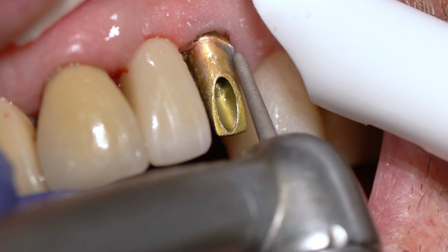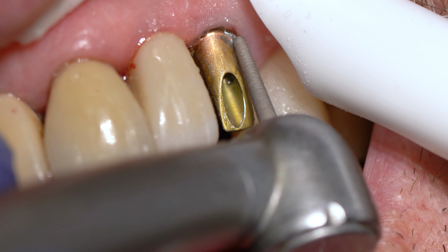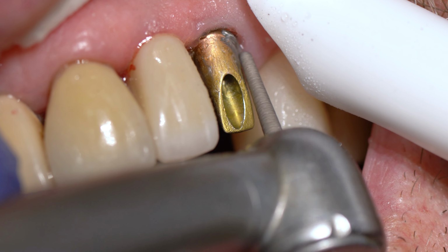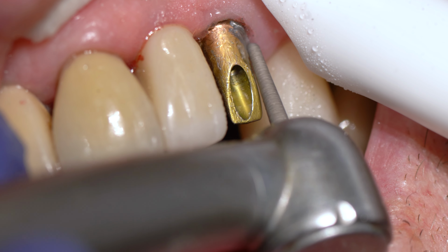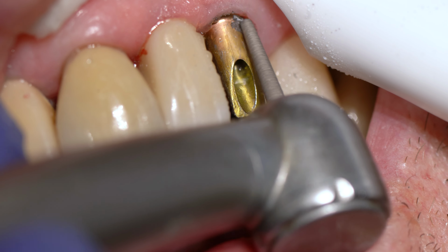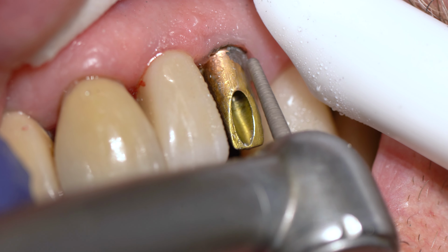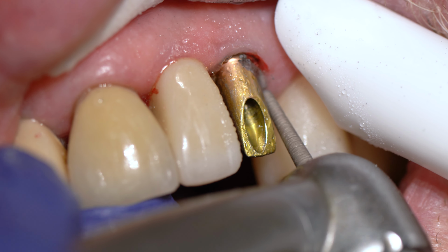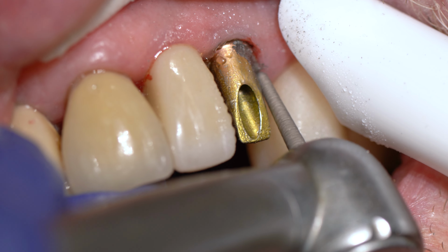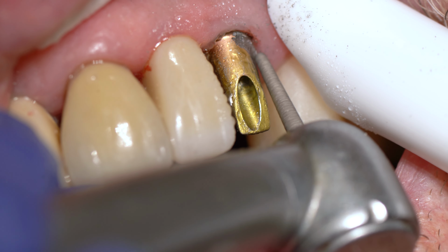So I'm just prepping that margin, that area in the margin right there. That was the only part that was really an issue. Now this is a gold anodized abutment. Because we used zirconia as the crown, you're not getting show-through from the abutment anyway, so it's not going to be an issue. If I was using something that's translucent, then it would be an issue, but I'm not. So I'm just prepping this margin carefully.